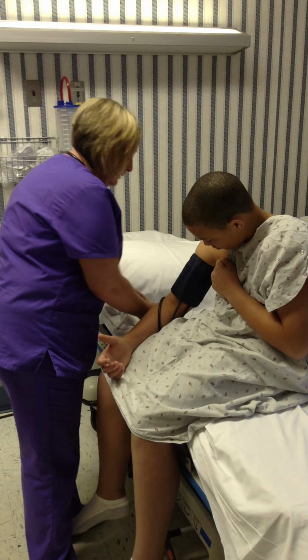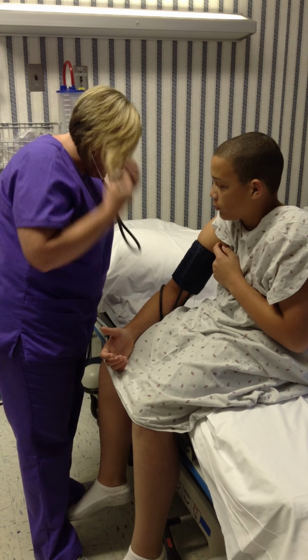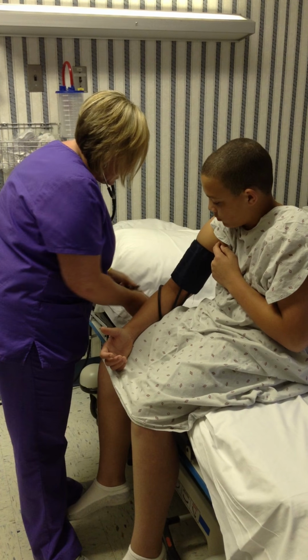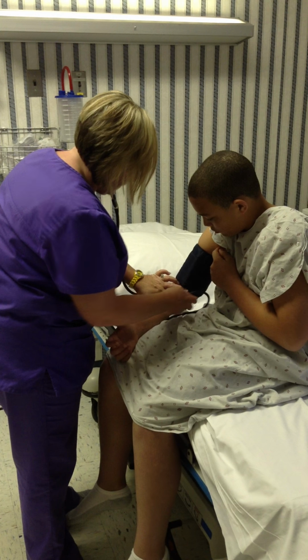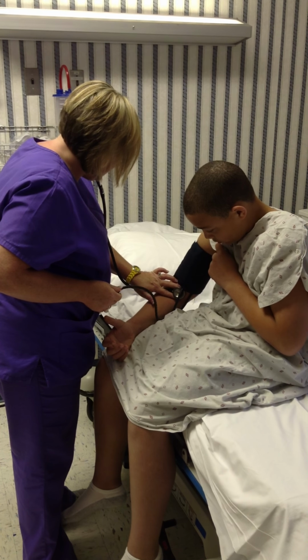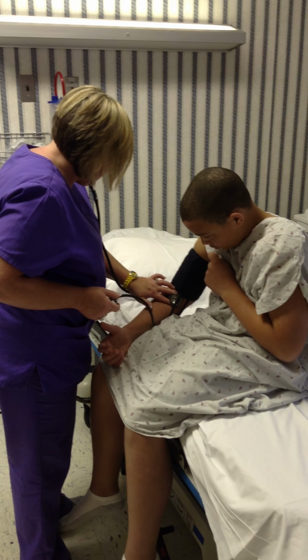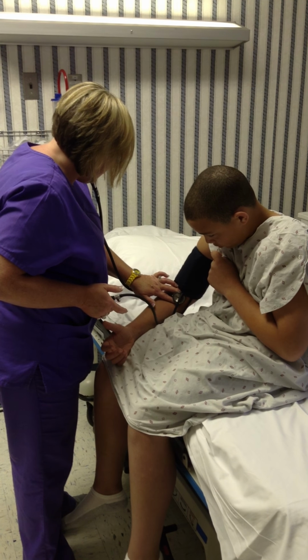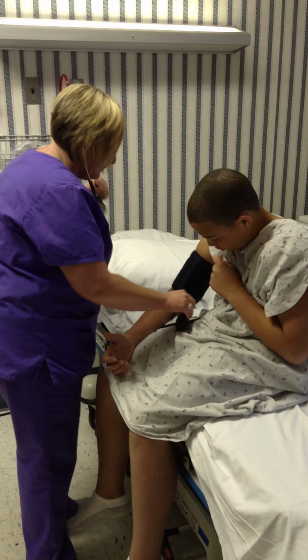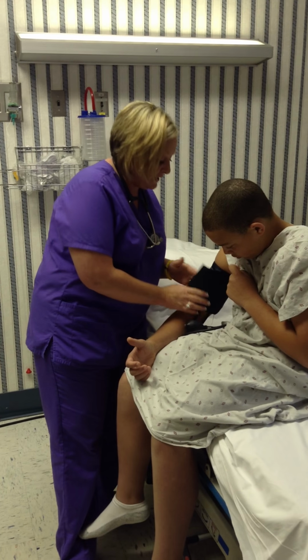All right. I'm going to put my stethoscope so I know where I need to go. I need to pump it up to 150. Okay. Micah's blood pressure is 132/72, and that is normal.